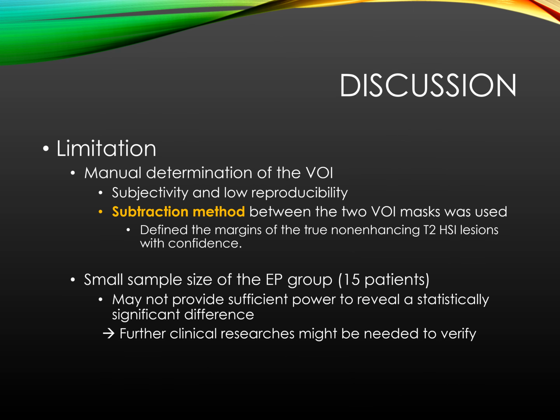Limitations. Because of the manual determination of the VOI, there may be limitations of subjectivity and low reproducibility. However, using the aforementioned subtraction method between the two VOI masks, we define the margins of the true non-enhancing T2-high signal intensity regions with confidence. The small sample size of the EP group, 15 patients, may not provide sufficient power to reveal a statistically significant difference in the diagnostic accuracies. Further clinical research might be needed to verify our study results.